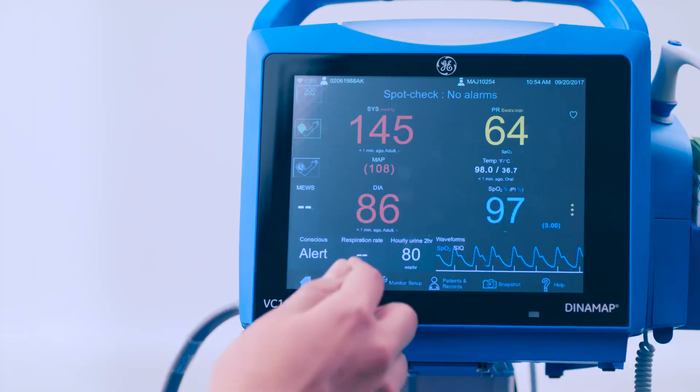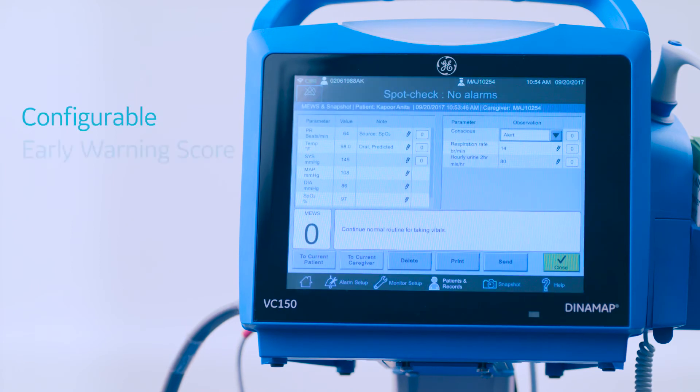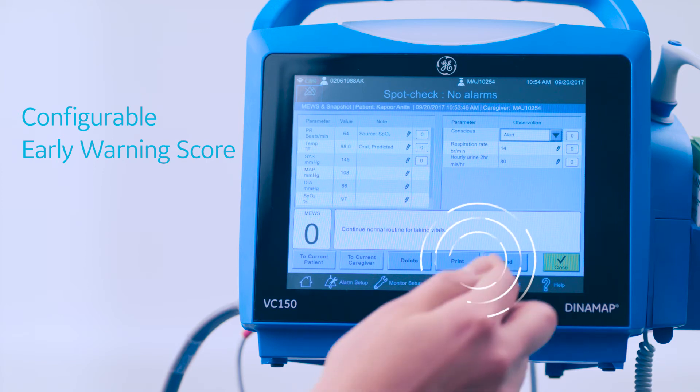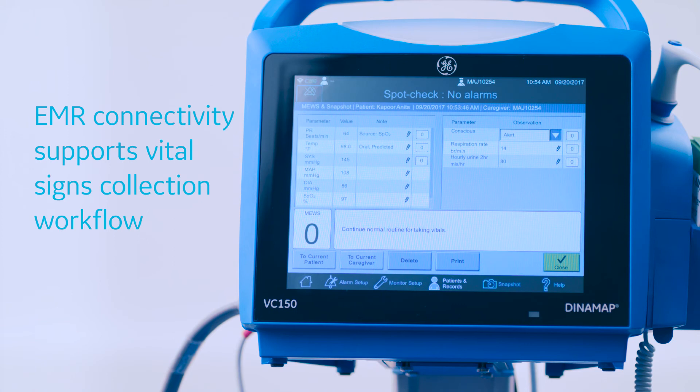After completing the measurement, add manual observations such as respiration rate. If optional early warning score is in use, the score is calculated after all required information has been charted. Send the vital signs and patient data directly to the hospital's EMR.